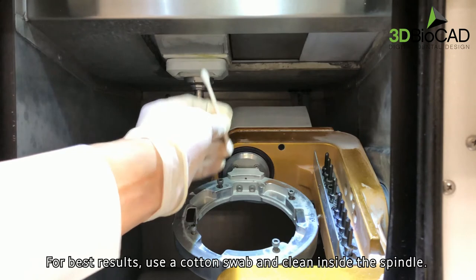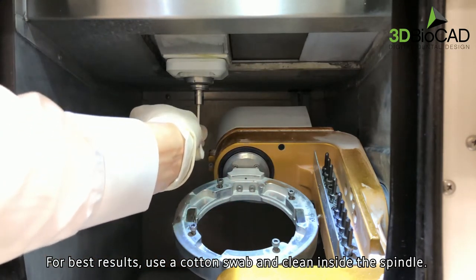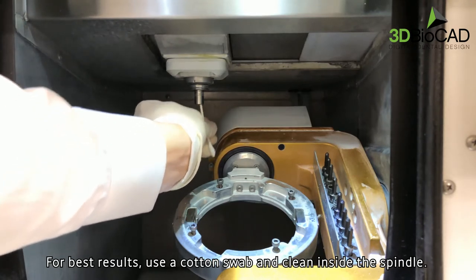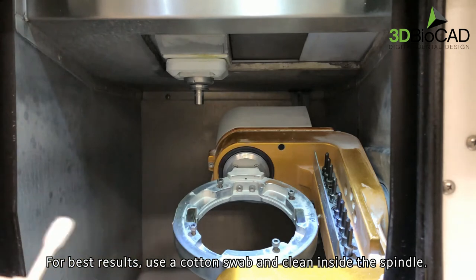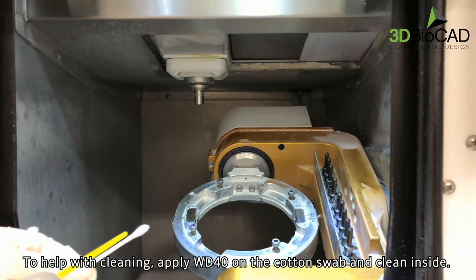For best results, use a cotton swab and clean inside the spindle. To help with cleaning, apply WD-40 on a cotton swab and clean inside.